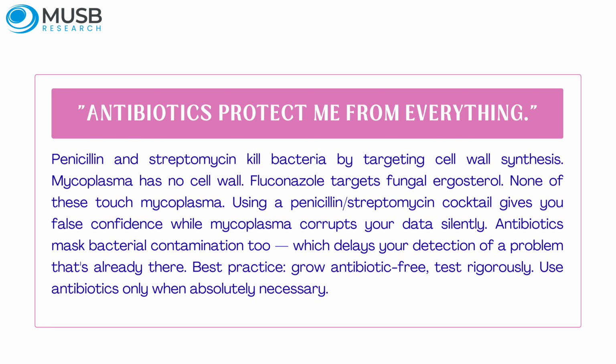Best practice. Grow antibiotic-free, test rigorously. Use antibiotics only when absolutely necessary.